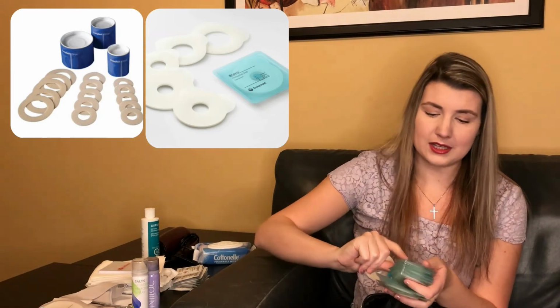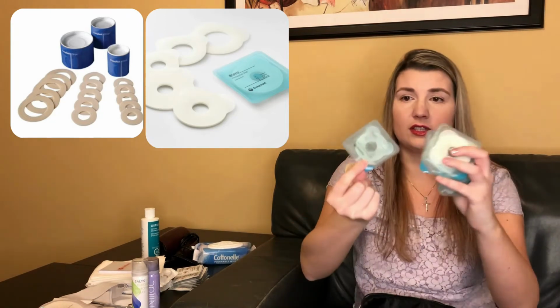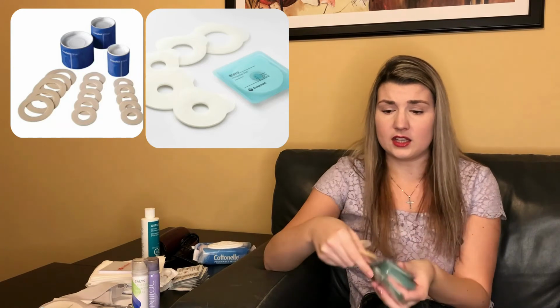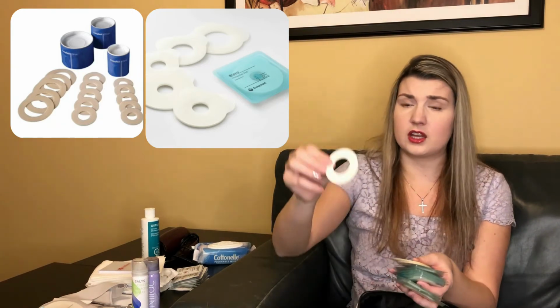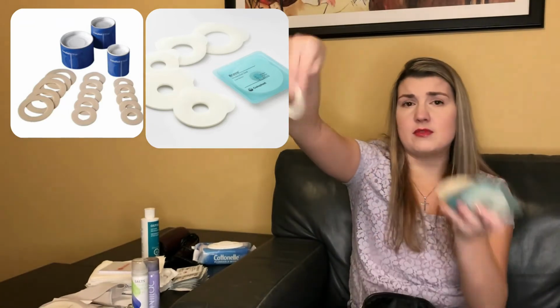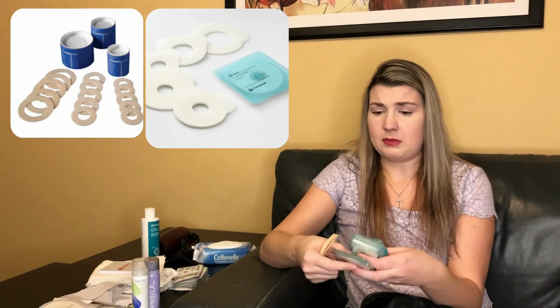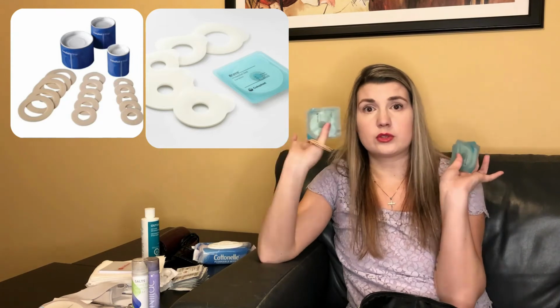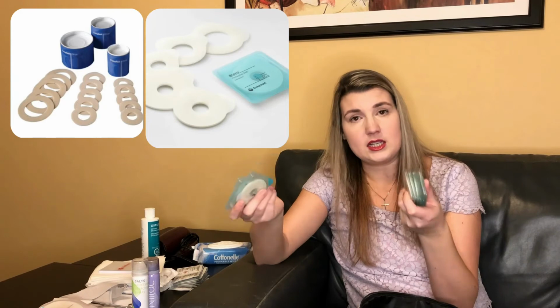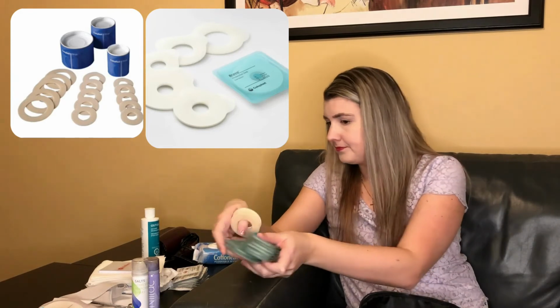These are the Coloplast protective rings. And I have a couple different sizes, big ones and little ones, so different surface areas. And then these ones are actually my favorite. They're sticky on one side, not sticky on the other. They're actually pre-cut, so I just cut them and wrap them around. So it just depends on what I want to use. So I bring choices. And again, I'll bring enough for how many days I'm gone, plus some extra.